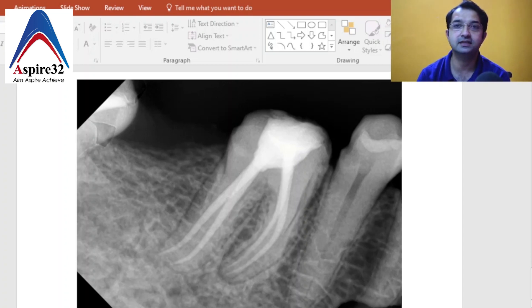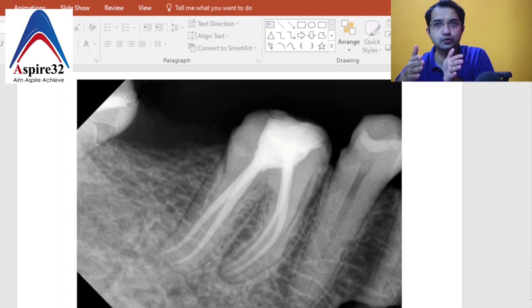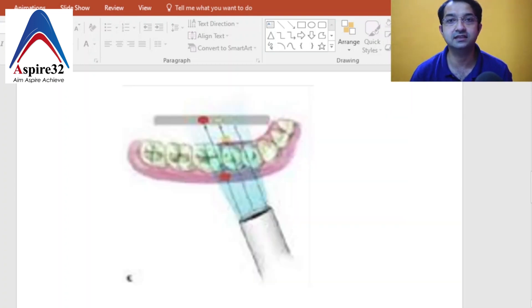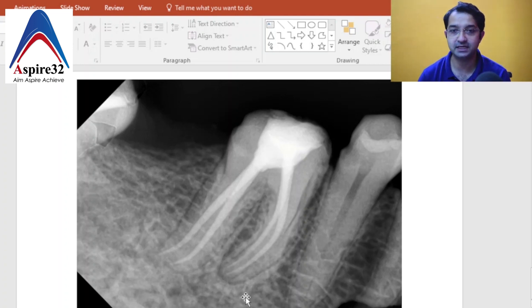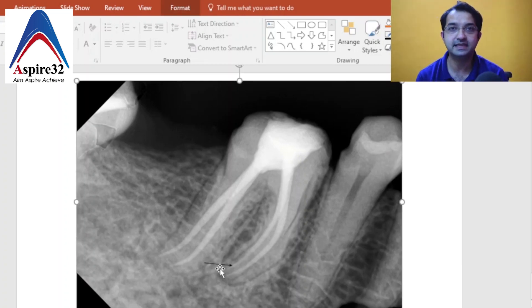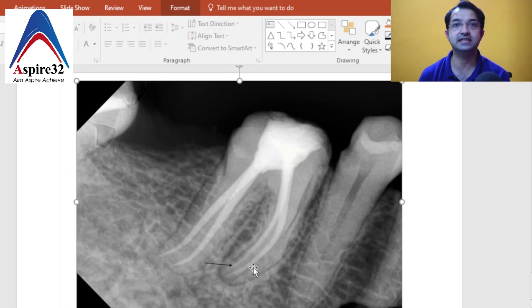Let me explain with the same X-ray. I have given mesial angulation — that means I moved the X-ray head from the perpendicular position to the mesial side, so the rays are now directed from mesial towards distal. Whenever you do that, the buccal canal is always the more distal-appearing canal in each root. So the second canal, which appears distal after giving mesial angulation, is always the mesio-buccal, and the front one has to be the mesio-lingual.